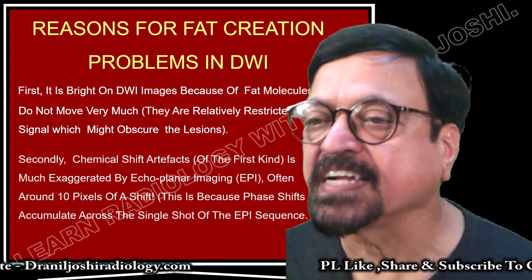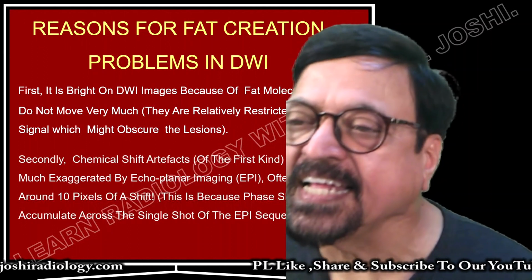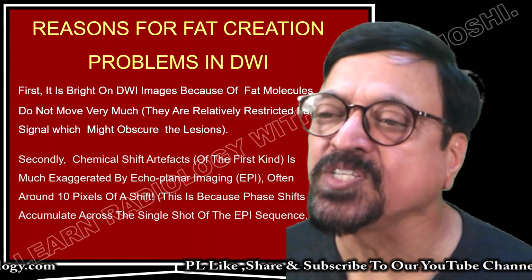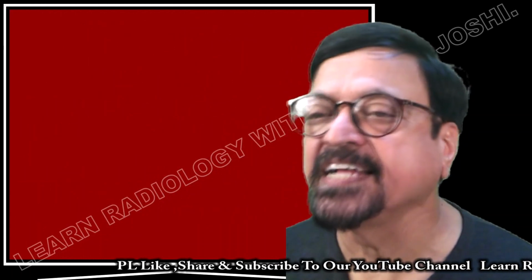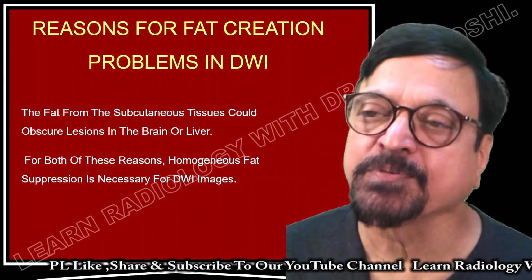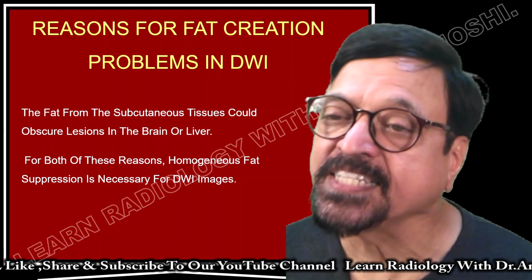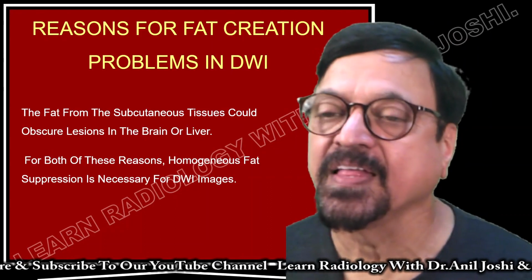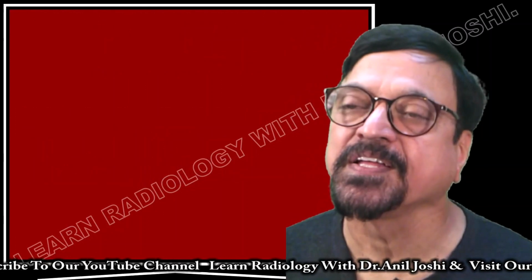Secondly, the chemical shift artifact of the first kind is much exaggerated by echo-planar imaging (EPI), often around 10 pixels of shift. This is because phase shift accumulates across the single shot of the EPI sequences. The fat from the subcutaneous tissues could obscure lesions in the brain and liver. For both of these reasons, homogeneous fat suppression is necessary for DWI images.